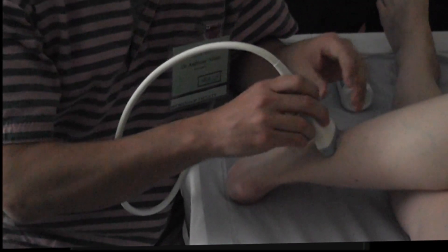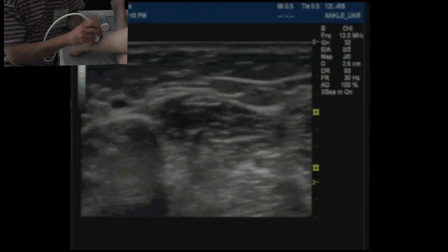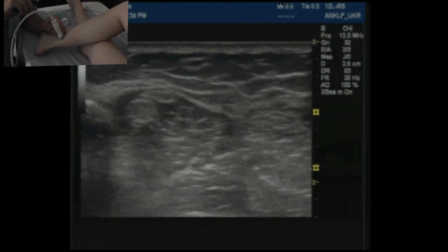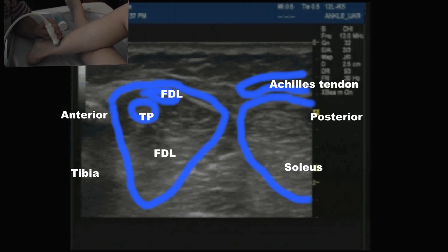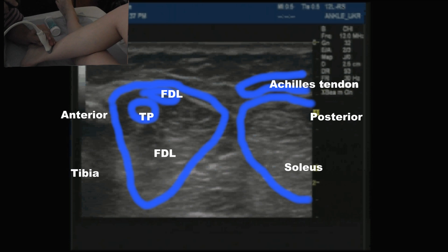So we're going to come slightly above the medial malleolus, probably 5 or so centimetres there, and we're going to start identifying all of the structures, because we can see and identify everything. So this is anterior, this is posterior. Anteriorly we've got tibia, and then there are two tendons — one here and one here. This is tibialis posterior, and this is flexor digitorum longus. The belly that you see here is muscle, associated with the tendon of flexor digitorum longus, so it still has a muscular component at this level.